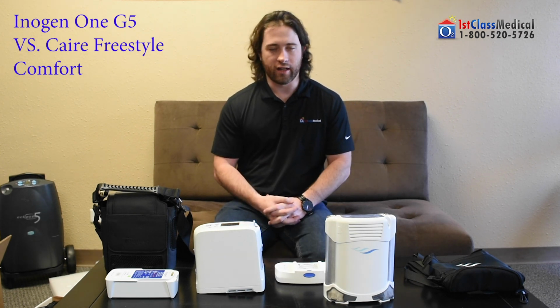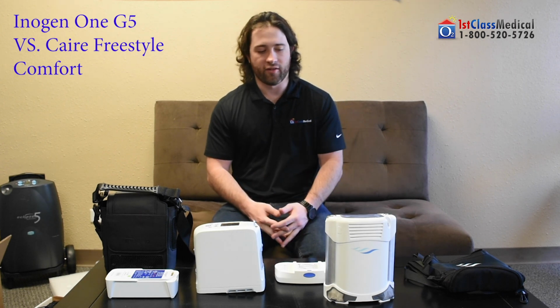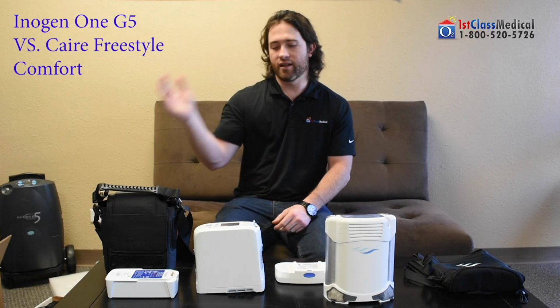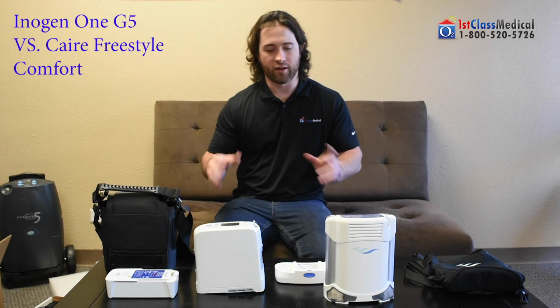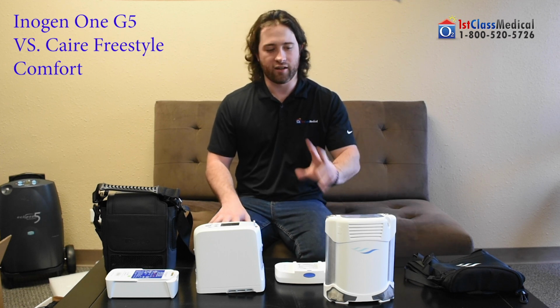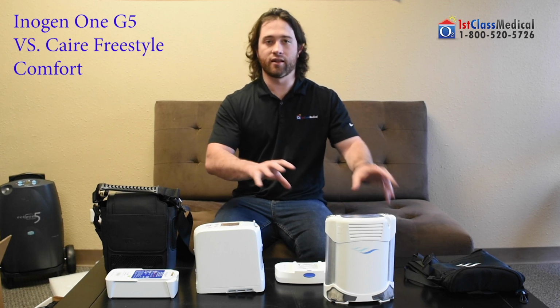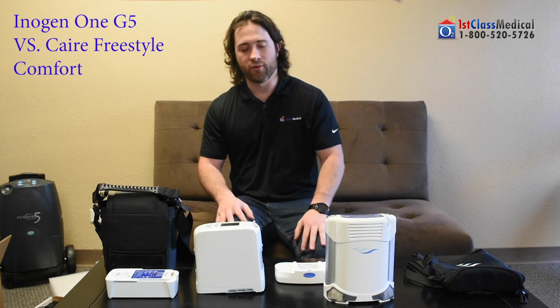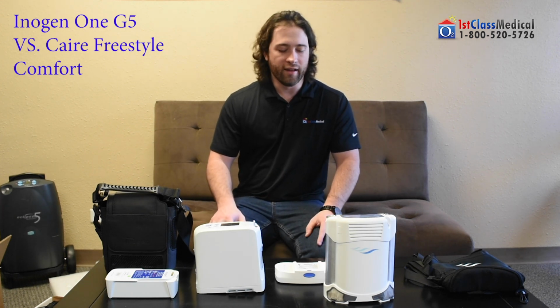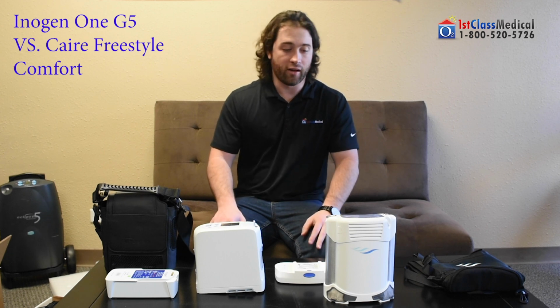As always, we have trade and buyback programs. So let's say the G5 or the Caire Freestyle Comfort you have for a couple of years, and then down the road you want to trade it in. You'll be able to trade those in for the newer models, because I can tell you right now, with the success that the Freestyle Comfort's been having lately, they're not going anywhere with this specific model, and they will be constantly upgrading it, as Inogen has done with its G5, and they will both be big names moving forward. But hopefully this helps you decide which one you would rather have.